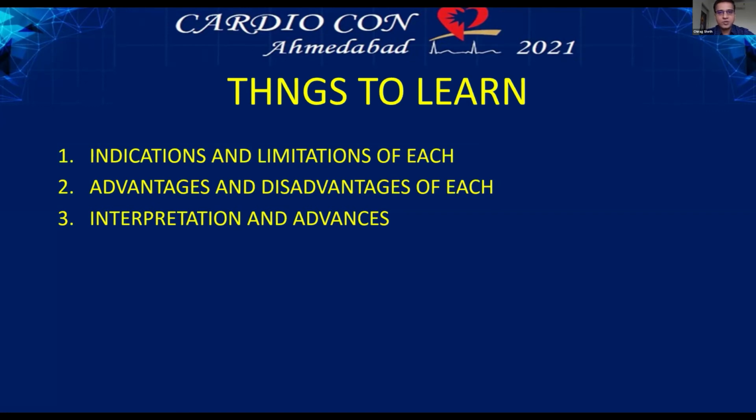That is the only thing in which IVUS is always going to be superior to OCT. Because of better resolution, definitely the extent of imaging and the clarity of image would be better with OCT, no doubt about it. And therefore, the debate should be no imaging versus imaging rather than OCT versus IVUS.